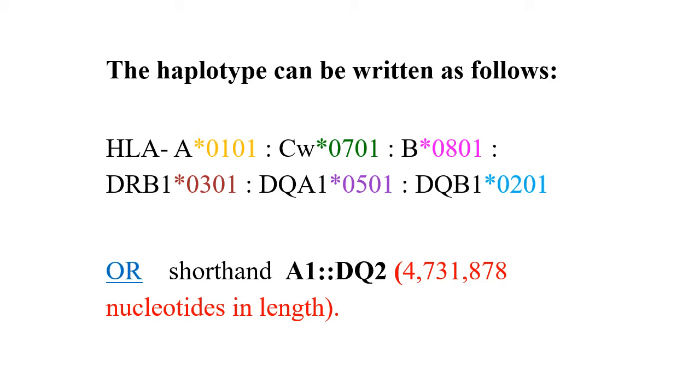Or some references or some methods shorten the naming of the haplotype.